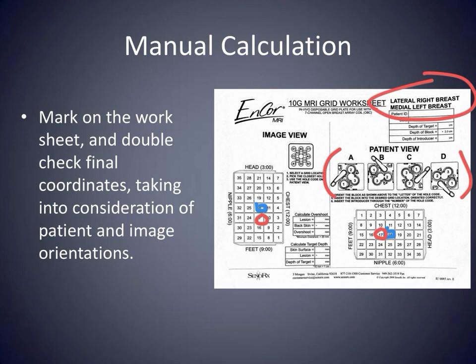Once again, these worksheets are provided by our manufacturer. The depth of the block, in this case 2 centimeters, has already been pre-filled in the depth calculation so you don't forget. And for the various systems, this adjustment factor may be different.